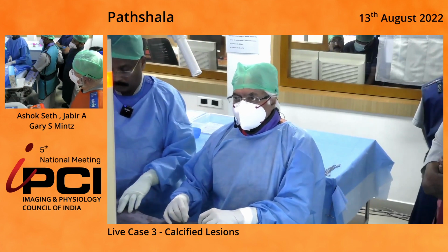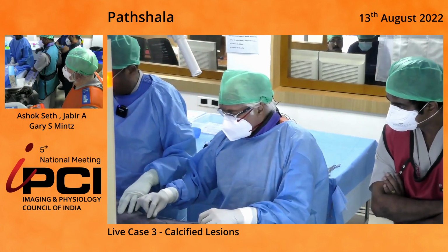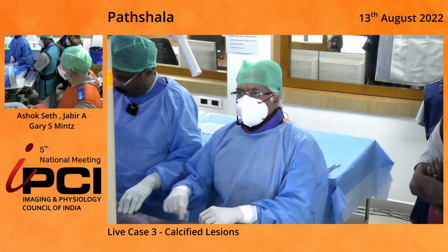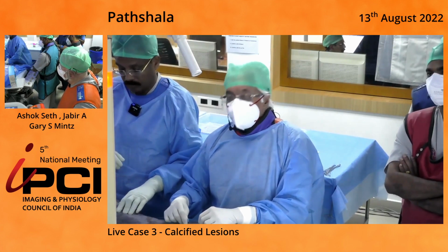But at this stage now, this is early stent. There is no tissue inside the stent. And therefore, it's just easy for us because now the IVL balloon would be directly on the metal, should we say, and there's no tissue or a pillow in between. So sorry, here we are.